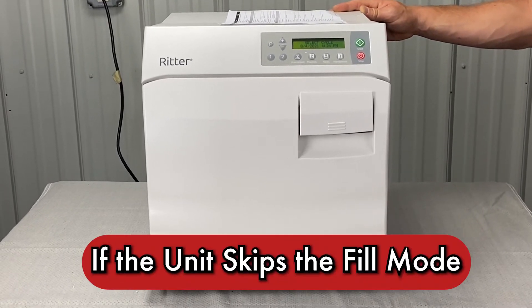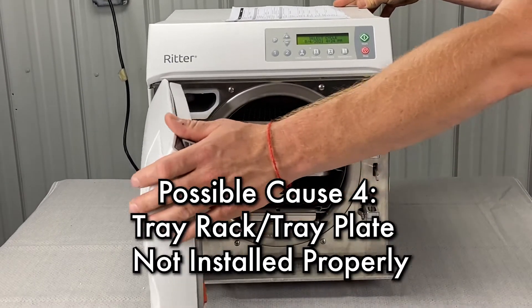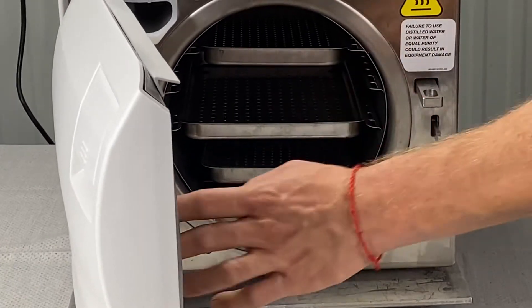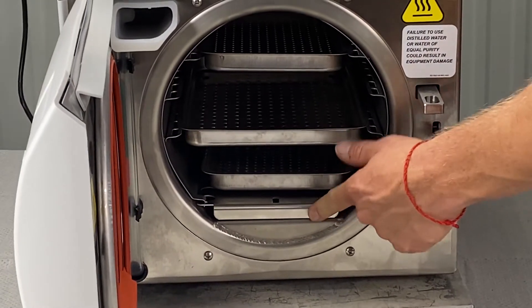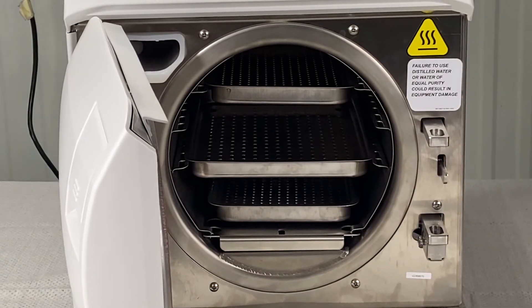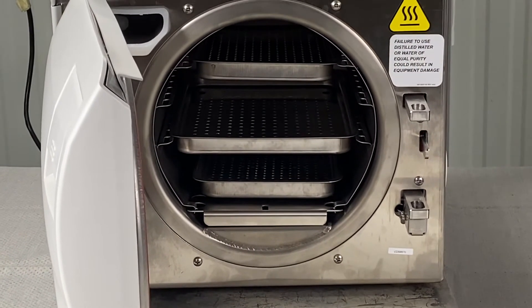If the unit skips the fill mode, make sure that the tray rack and tray plate are installed properly. The tray plate should be pushed in about an eighth of an inch — that will make sure it doesn't get in the way of the door closing, causing it to leak and throw this error.